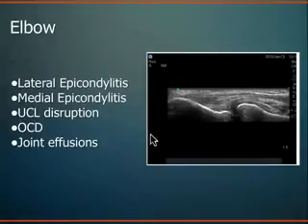So around the elbow, a couple of very common diagnoses, whether it's tennis elbow or golfer's elbow, lateral epicondylitis or medial epicondylitis. There are multiple names for it, but you can image those areas quite well. So this is the distal humerus, the humeral radial joint or capitellar radial joint, the radial head, and this is the extensor tendon coming in and attaching on the humerus lateral epicondyle here. So superficial, deep bone structure, tendon tissue coming across the joint space and attaching onto the lateral epicondyle.